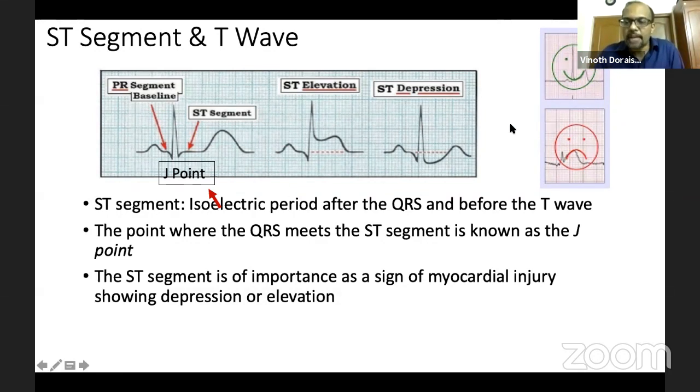When coming to the type of ST segment, you have two types over here. One is the smiley face, that is the concave ST segment elevation, and one is the frowning face, that is the convex ST segment elevation. Usually the sinister ST elevations are the ones which have the frowning face or the convex type. Concave ST segment elevations can be normally present in some patients, like in early repolarization syndrome, which can normally be present in children or athletes. But having said that, sometimes even myocardial infarctions can have the concave type of ST segment elevation.